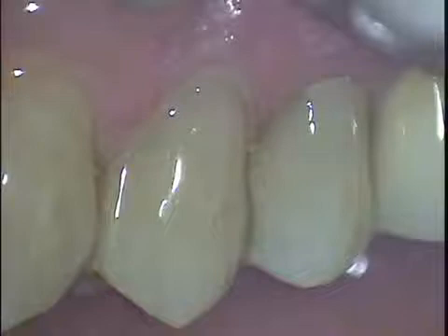This shows the finished case, showing excellent aesthetics and adaptability to the tooth.